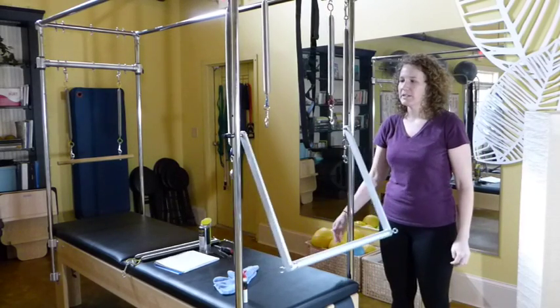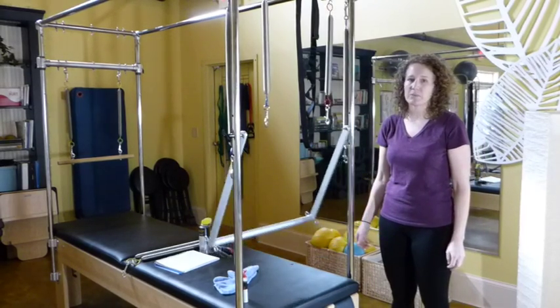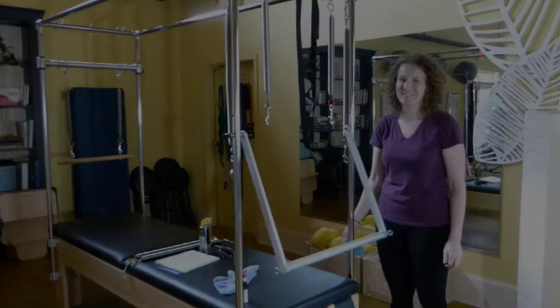Now, it'll be nice and smooth and quiet when it swings. One of the things I tell my clients is that if your push-through bar doesn't swing freely, or you have a really hard time making your sliders on the top of the canopy or on the side of the canopy slide, then that probably means that the whole frame is not square.